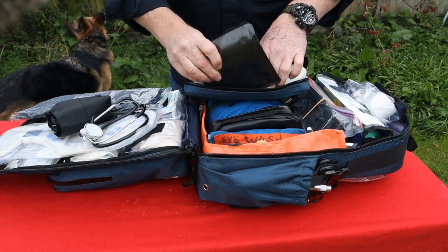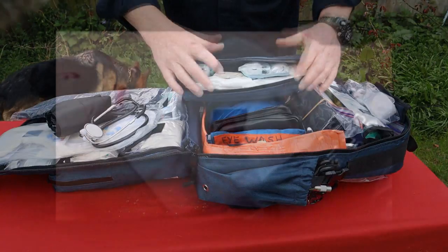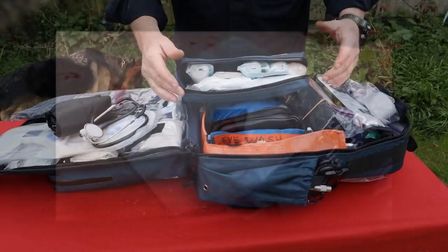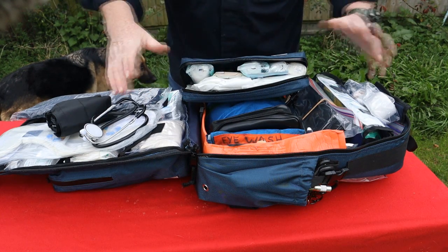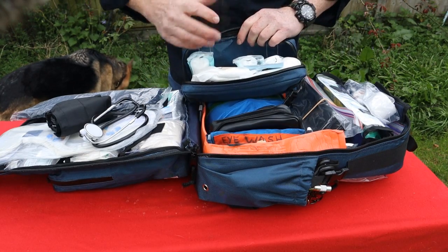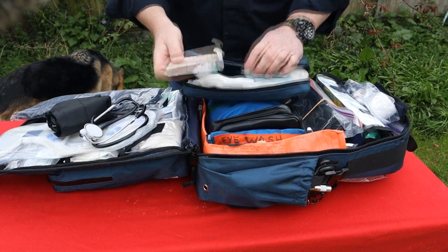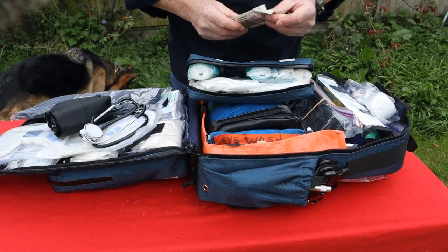So we've got, you know, a stabbing, impalement, whatever it is, whatever has punctured the chest, it needs to be sealed. Chest seals, if you haven't got chest seals, you know, black masking tape, somehow seal the chest. So this is my kind of immediate action bleeding type kit. Extensive blood loss, that's one of the first things I grab.